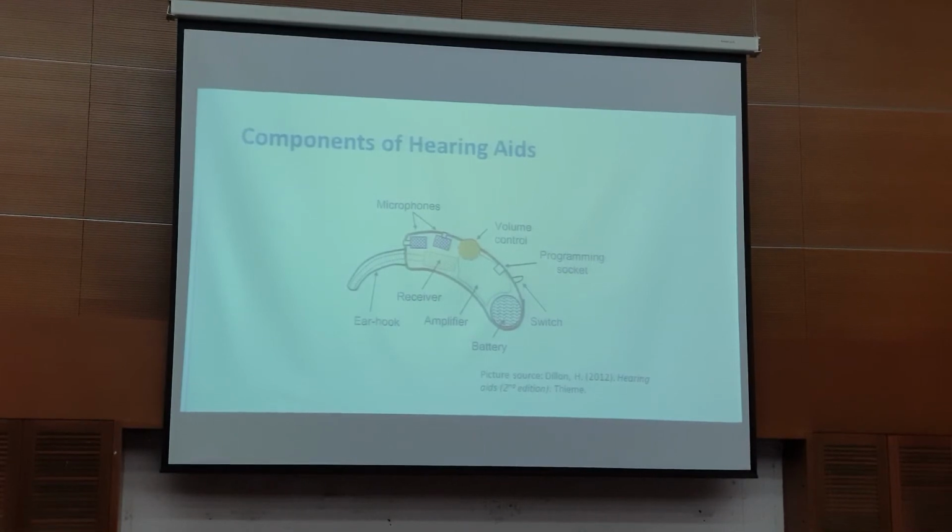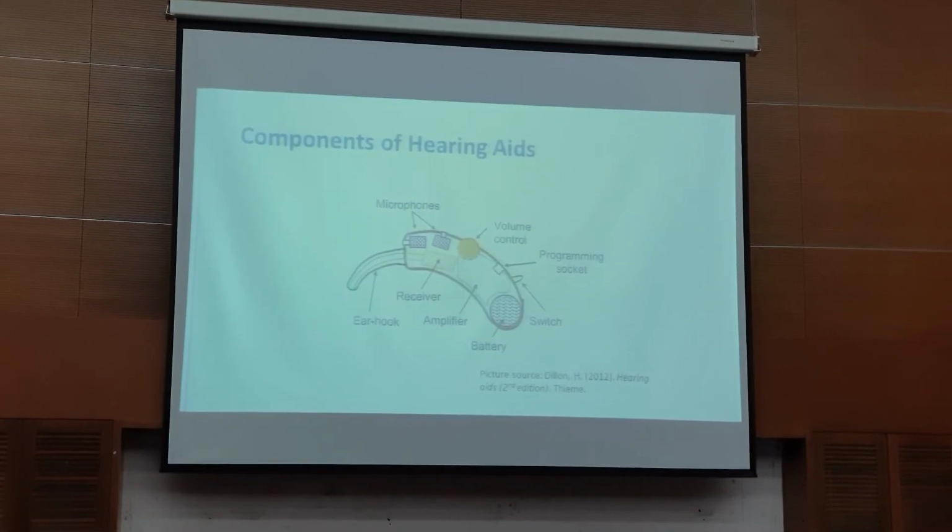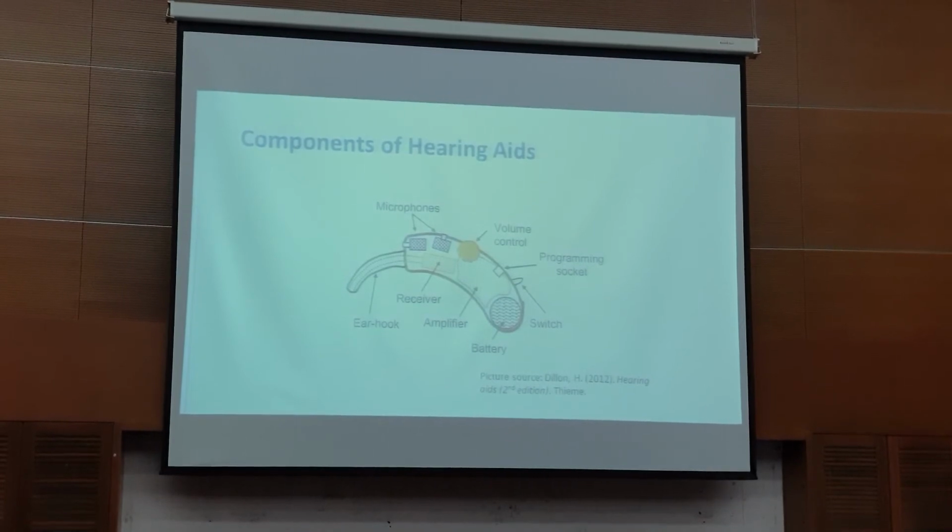Yeah. So all the hair cells are normal, right? It's functioning, it's doing all these things. So when the blockage or the problem is just at the outer and the middle ear, if you make the sound louder, then the sound can get in. Cochlear tak ada masalah, hantar signal to the brain. So they should be able to perceive the signal. Okay lah kan, tak ada distortion or anything like that.